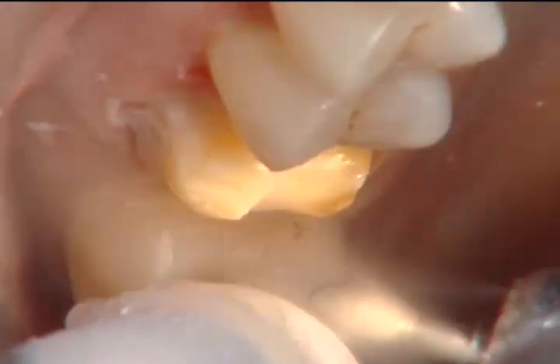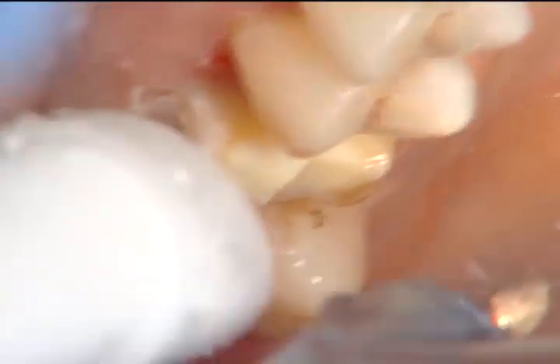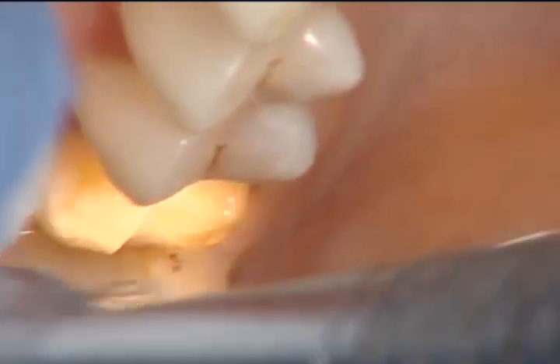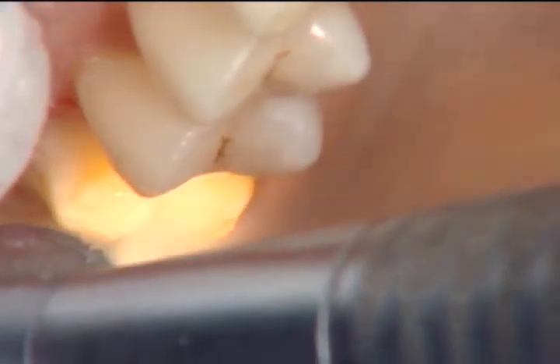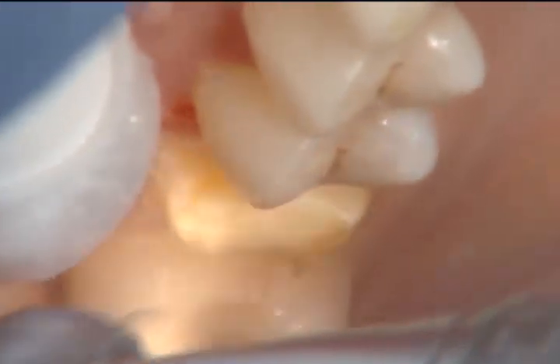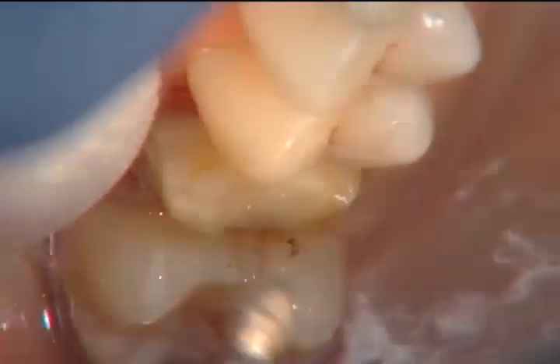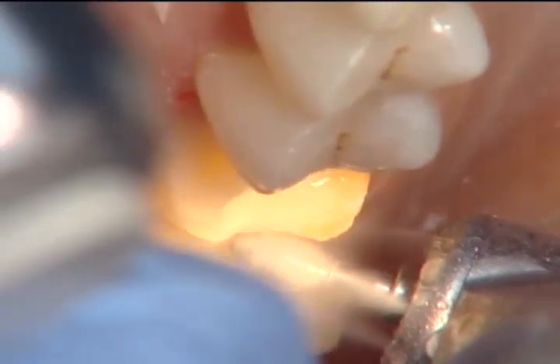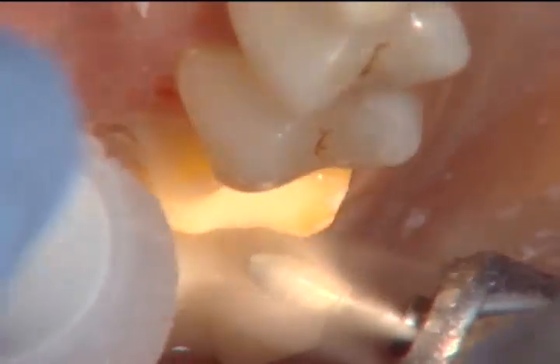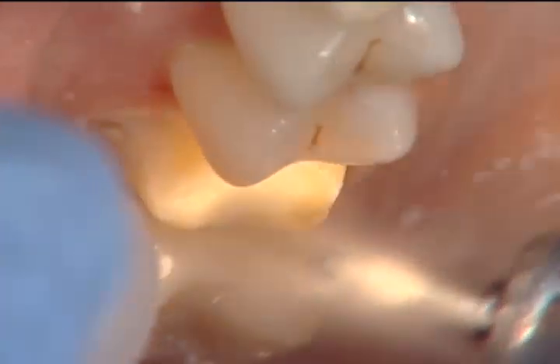Remember, we want to have the central groove nice and deep here. We don't want it to look flat like a tabletop on the occlusal surface of our preparation. It needs to mimic the central groove on the tooth in front of it, where the central groove is 2 millimeters down from where the cusp tips are. So we want to replicate those same kind of planes in our preparation. If we don't do this, the lab will still be able to make us a crown, but it won't look very real because they won't have any room for anatomy.